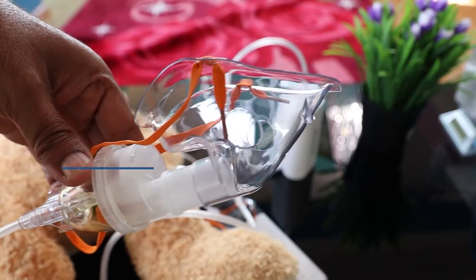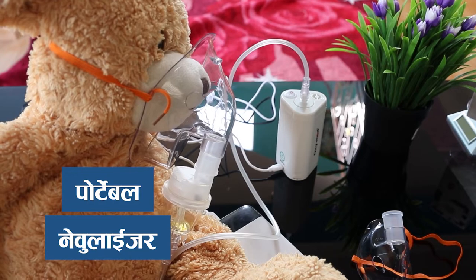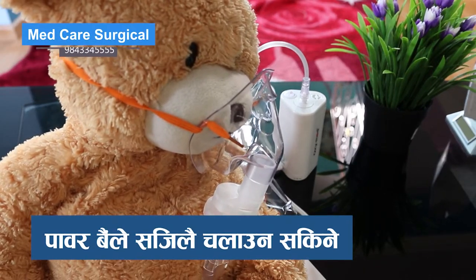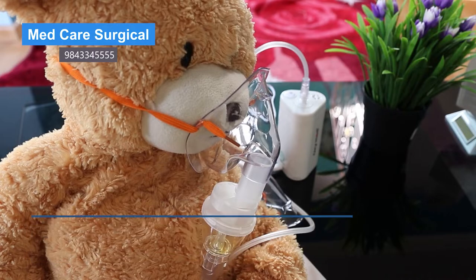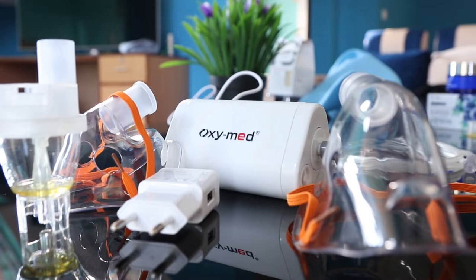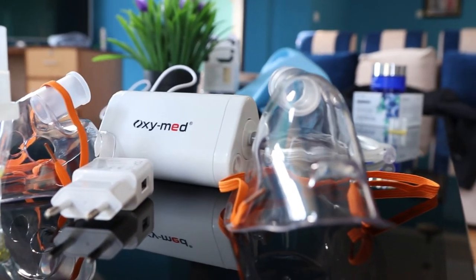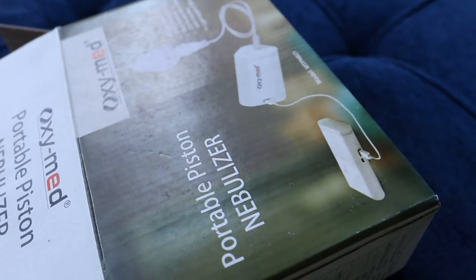I will place it in the right place. Coming up next is the OXIMATE Portable Nebulizer — I will talk about the details of the OXIMATE Portable Nebulizer.